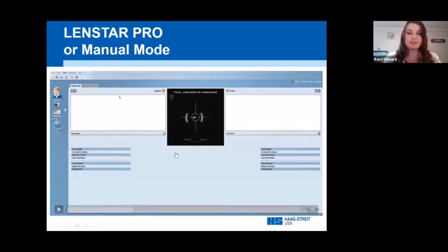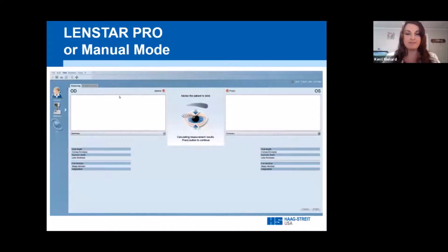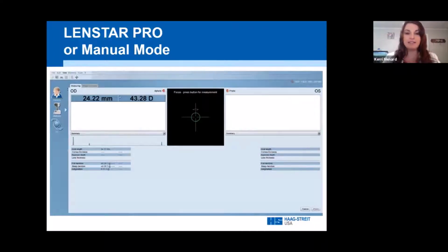But you can ignore these arrows when you have a green circle size smaller than the size of a quarter, like the coin, and that white light is well centered in this crosshair. At that point, when you have those 2 points, you can ignore the arrows and click the joystick button to measure. Measurement will go around, and there is a flash at the end. The technician will have to click again, and then when they're in good position, they will click in the measurement.